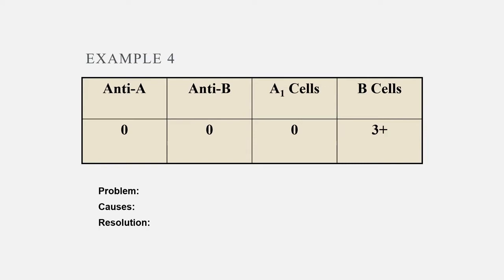Anti-A,B is an antisera that should be in your rack. The thing you need to know about ABO antisera is that anti-A and anti-B are IgM. That's why we can do immediate spin testing for IgM. IgM are pentamers. You're familiar with what those look like?